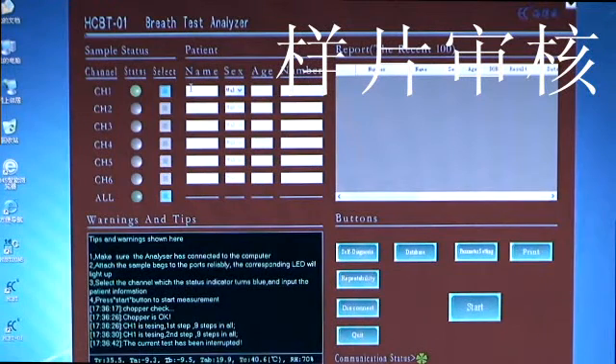Main Interface Functions and Operations. 1. Sample Channel Selection Column: the channel number signifies the sample connector number. Each channel number corresponds to a set of sample connectors, and each interface corresponds to a status indicator and a selection box. When a set of samples are inserted correctly, the corresponding status indicator will light. To measure, click the corresponding checkbox to select. Only when two samples are inserted correctly and the status indicator lights can the channel be checked.